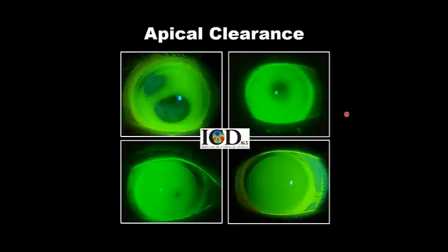So just in summary, the way we would go about fitting the ICD 16.5 is rule number 1 is apical clearance. If the lens goes on eye and it hits the cornea, you should be going 300 to 400 microns higher in depth. If it becomes very easy to make out eye anatomy, where you may have a high point in the surface, you may want to add 200 microns more depth. If this is on insertion, it may not allow for the normal sinking of these lenses into the conj.